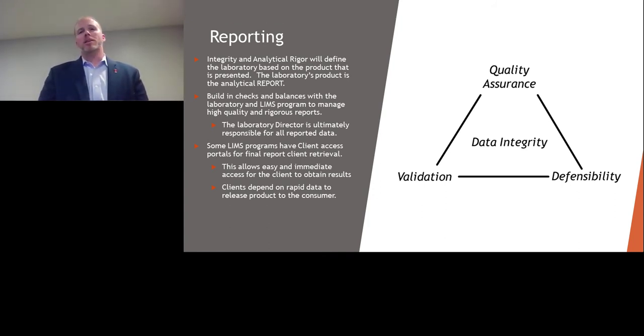In your report, it is essential that you can stand behind the numbers you are producing, that they are defensible because everything you have is validated, and you have a quality assurance plan or a quality management system. So you have your checks and balances built in, not just to eliminate human error, but also so that your instruments and your calibrations are always in check, and you are able to stand behind your data.